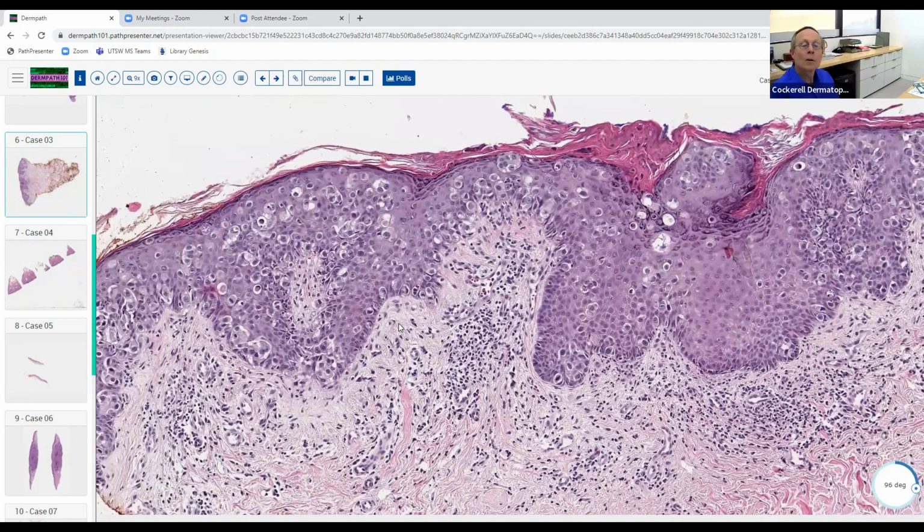Good. Now, even though this is relatively easy, this is just right down the middle of the fairway for a board examination question. So you're going to see this. So if you can get this right today, that's good. Now it's so obvious here, they're probably going to ask you a differential diagnostic type question, maybe a special stain type of question, maybe is there anything else you should look for kind of question here. So, a second order question here.